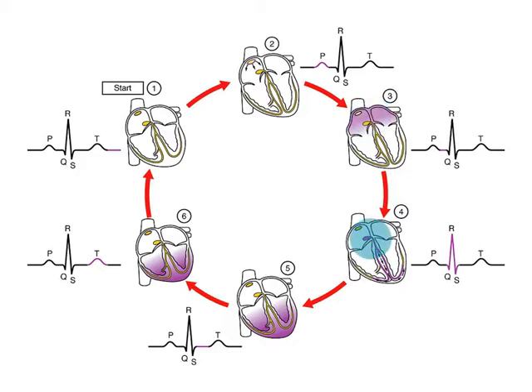The obvious characteristic of an ECG trace is the QRS complex. The signal is relayed from the SA node to the AV node, atrioventricular node, a little purple bulb in the middle between the atria and the ventricles. That signal spreads through the bundle branches, to the Purkinje fibers, all the way around the ventricles of the heart to squeeze and contract the heart. Again, the signal is what we register. The contraction occurs later, during the interval.